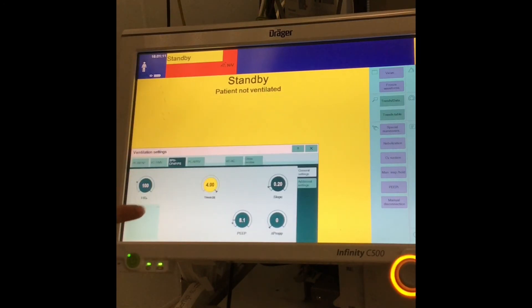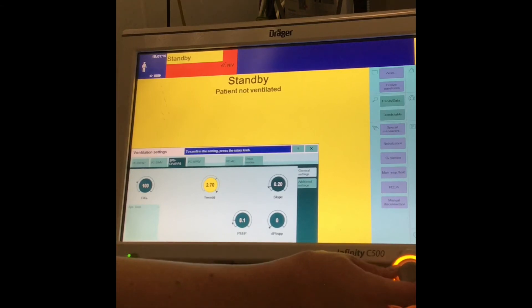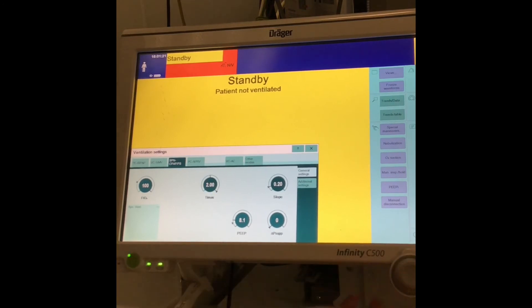The other thing to be mindful of is that your T max needs to be reduced to two, and then just increase it as your patient needs.